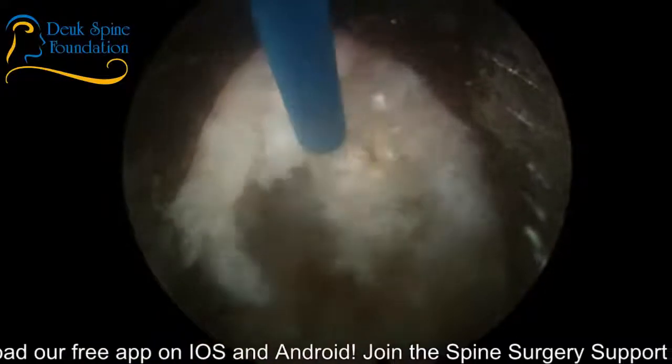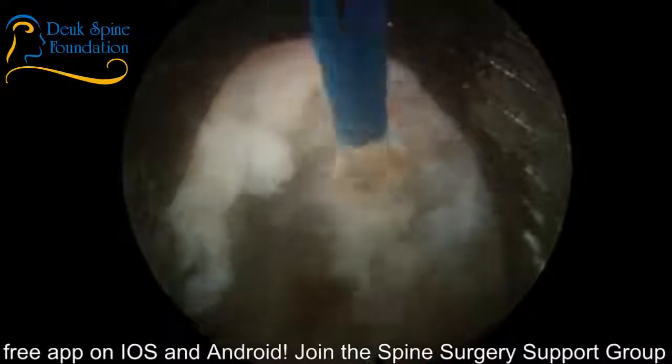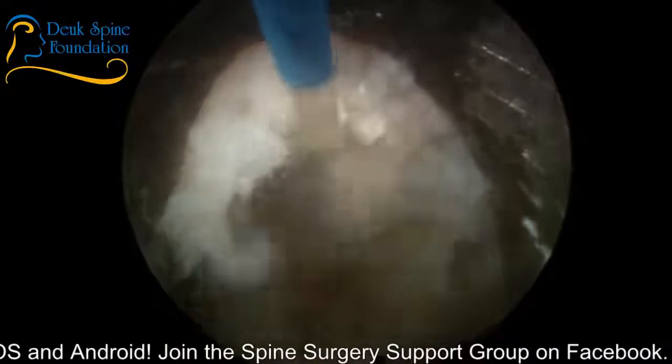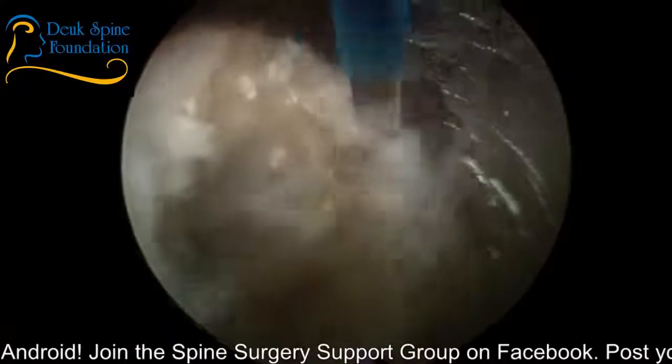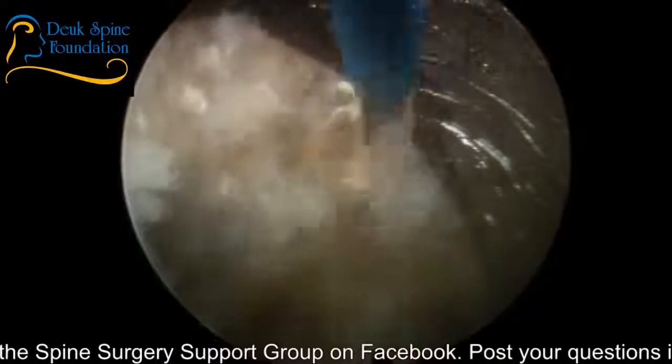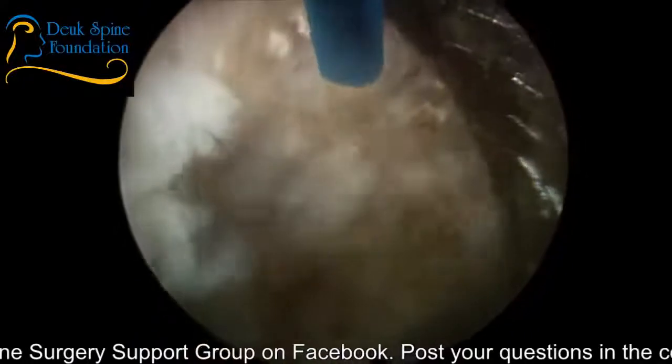This is what I was talking about earlier. All this stuff here related to the inflammation from the tear. This is all calcified, basically scar tissue, right through here.